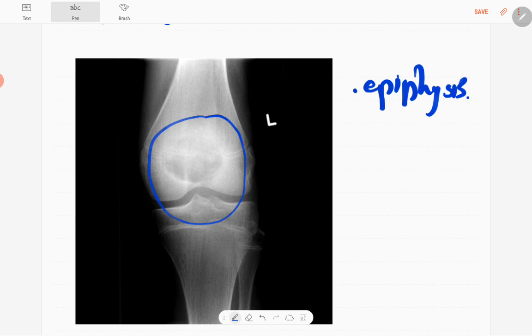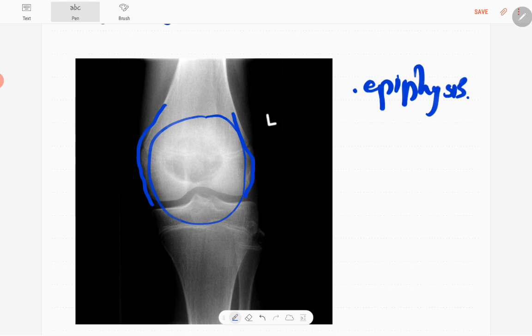This is involving the physis or the growth plate and distal metaphysis. It has a sclerotic margin, no expansion of the bone, and the cortex is intact. No endosteal scalloping or cortical breach.